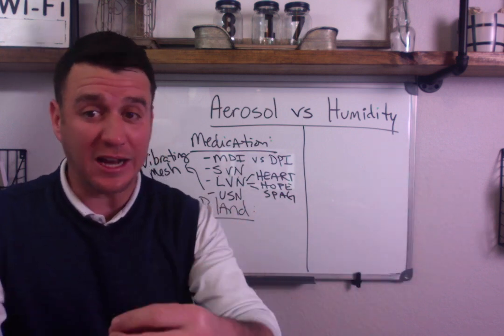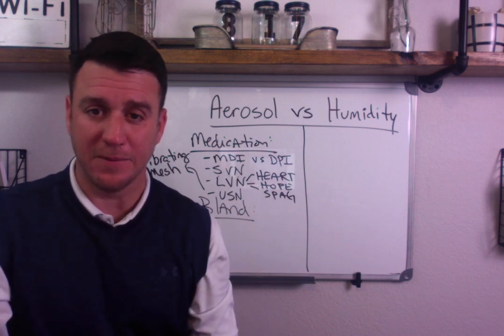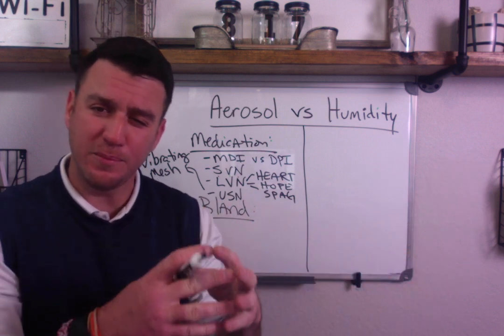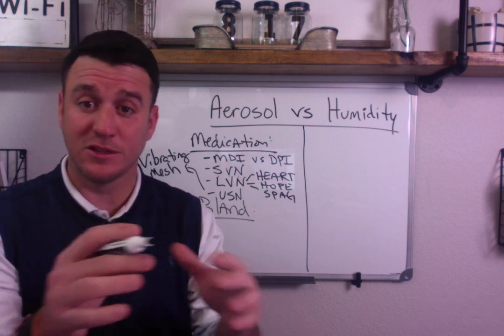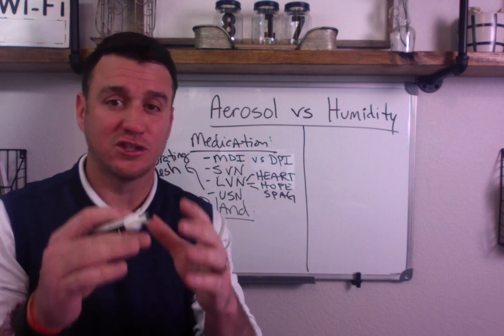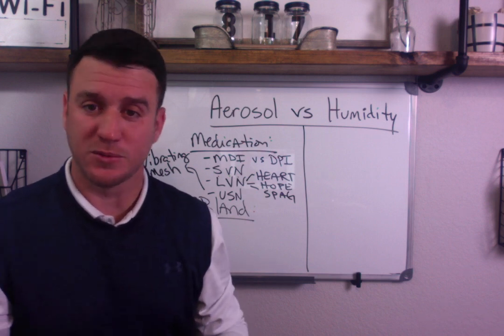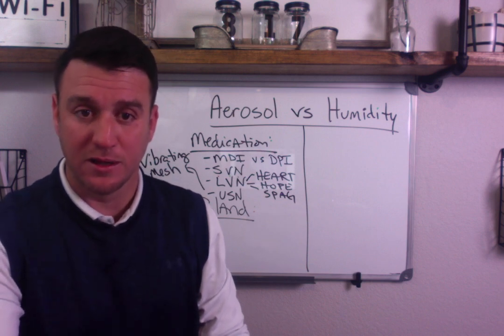And so you're going to be documenting false numbers. Don't document 15 liters per minute when the patient's true minute ventilation is 9 liters per minute. Okay, so you want to be aware of that. The vibrating mesh nebulizers, the Aerogens, they do not add flow to the circuit. And so you can start your treatment and then do your vent assessment, and understand if you're working from a time management perspective and you were told start your treatment and then do your assessment, then that's fine.